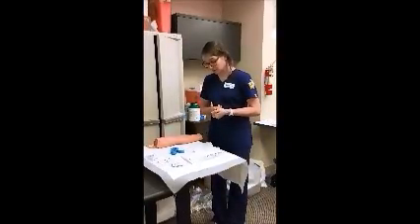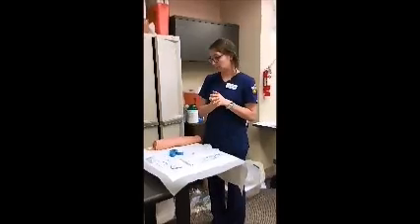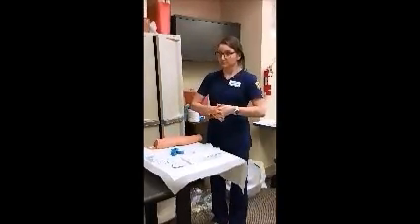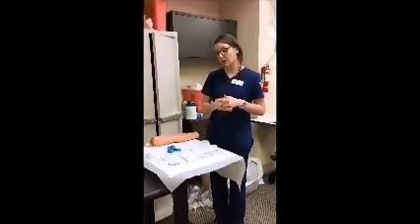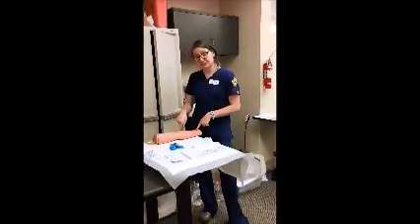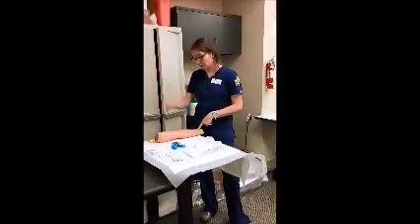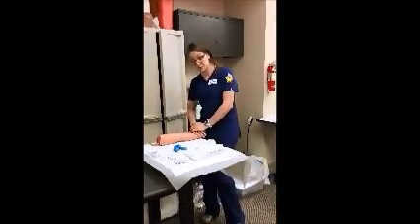Once he verified his birthday, I would go ahead and verify with him the ins and outs of an IV infusion, ask him if he's ever had one. Born in 78, so chances are he's probably had one before. Even if he says he's had one, I would go through a rundown. We're going to tell him we're going to insert a very small needle into one of his veins. And then this plastic catheter will go up into the vein, and we'll secure that and run fluids through it, as the provider has ordered 1,000 milliliters of fluid.